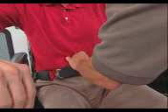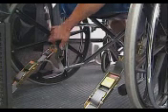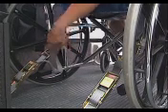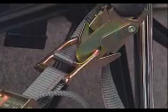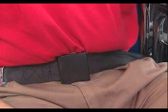Remember to position the lap belt around the occupant's pelvic zone near the hip, with the buckle of the lap belt placed opposite to the side where the shoulder belt is attached to the wall. For integrated lap belts, take the snap hook end of the belt and attach it directly to the D-ring on the rear securement strap assembly. Adjust the lap belt through the adjusters by pulling on the free end to make the fit firm yet comfortable.